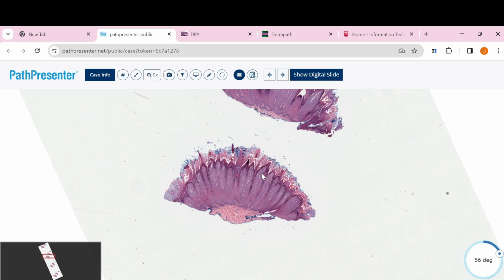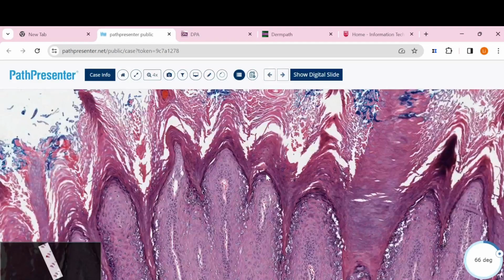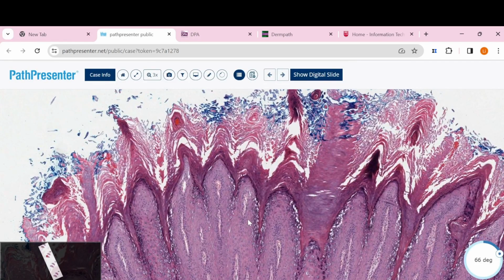We can always see parakeratosis in this tip. Sometimes between these two tips, in this area, we have hyperkeratosis, but from this tip and going up, we can see parakeratosis, usually something like this. Then these are the virus-infected cells, which we call koilocytes, but just pay attention to this lesion. This is a really nice fresh wart.